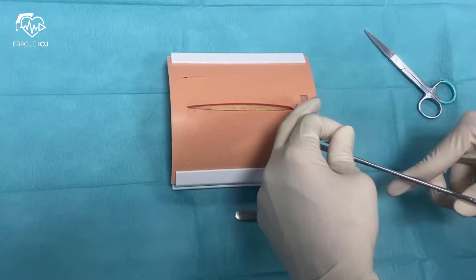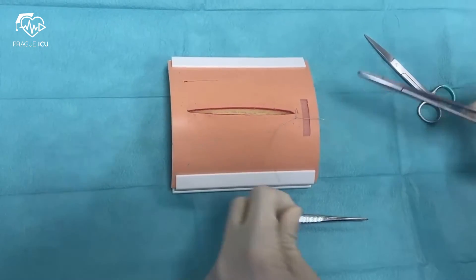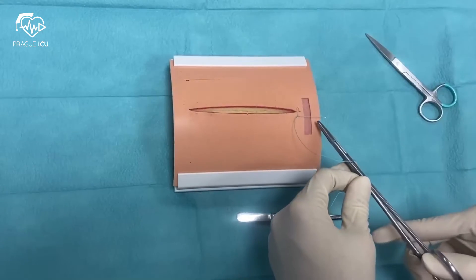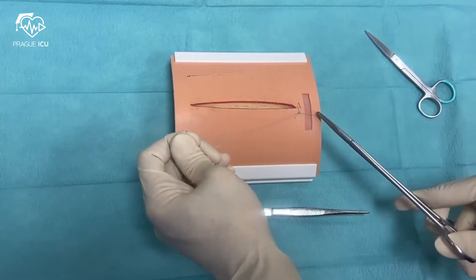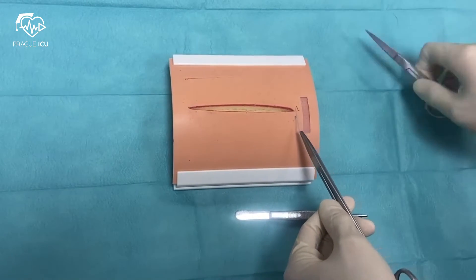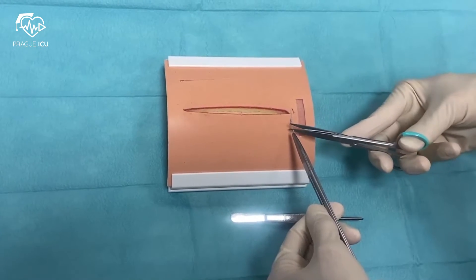You can tie the knots with hands or using instruments. Depending on the thread material, you should place at least 3 knots using multifilament thread and 4-7 knots using monofilament threads.